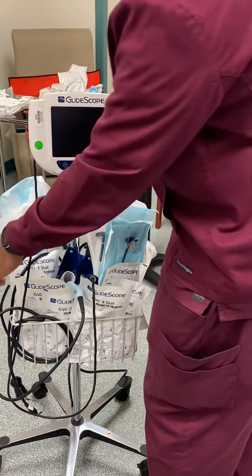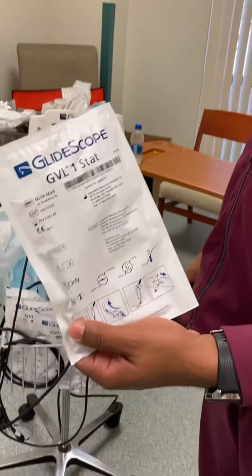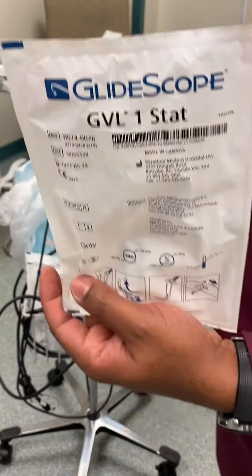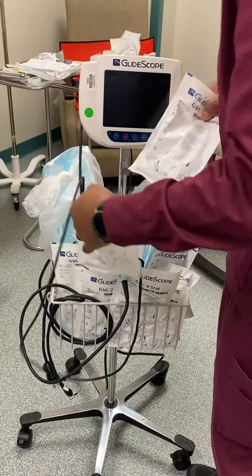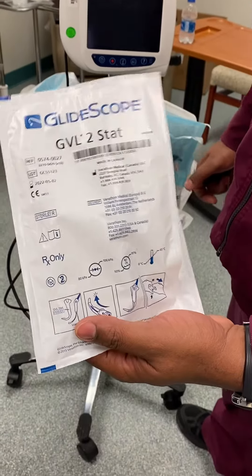This one is for the neonate. You hold the button down for a few seconds and it goes off. Then you're always going to make sure there's a size one for neonates and a size two for pediatric.